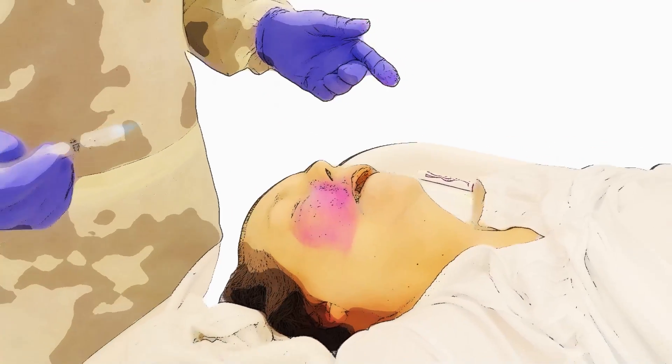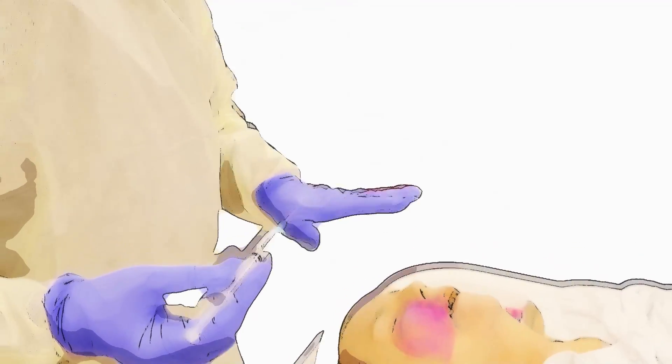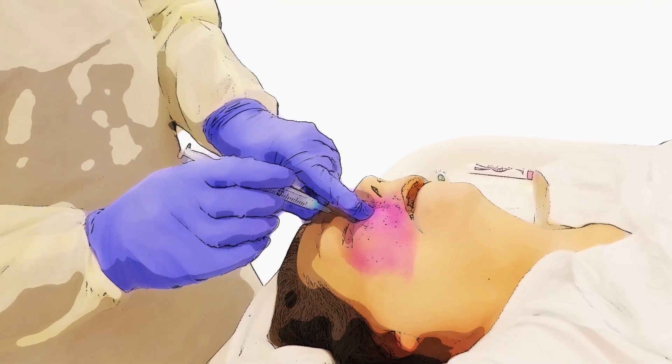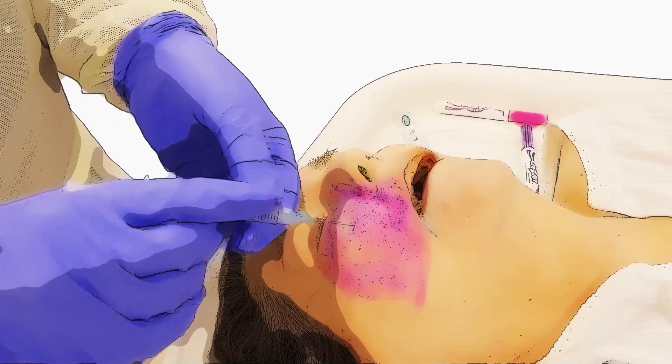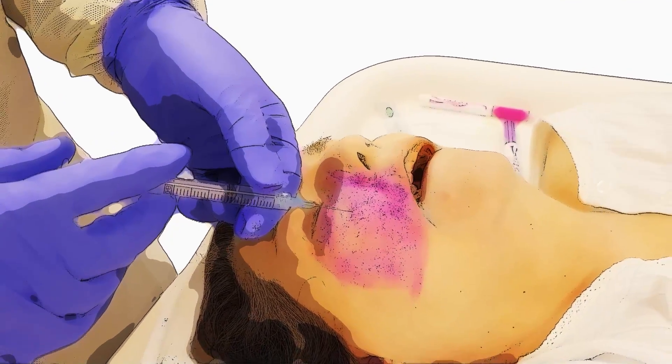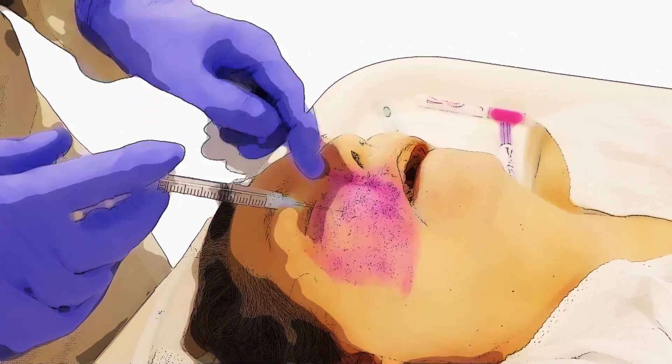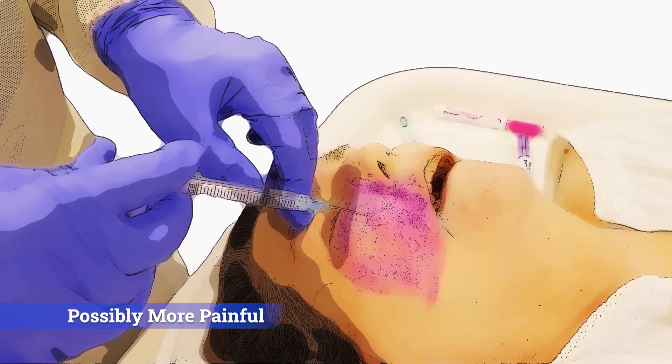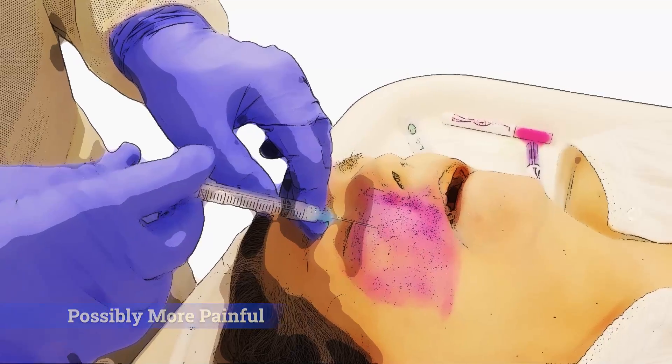Now the second technique - again, this would be all done sterilely. You can find your foramen and then go directly up to it, not into the nerve, not into the foramen, but just up directly to it, and then inject one or two mLs of your medication.